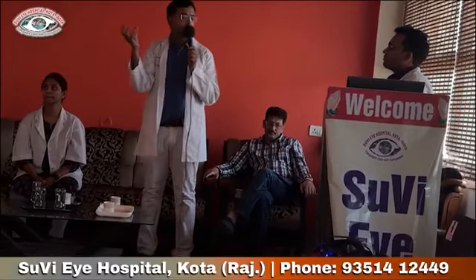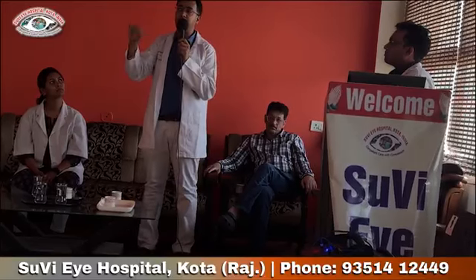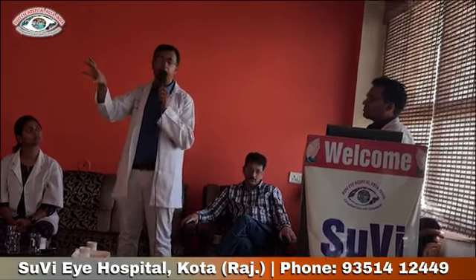So in patients with multiple NV and aggressive PDR, even without macular edema, we can do a double therapy, a double attack in that sense: do a tight PRP as well, and give an anti-VEGF also to regress the NV.